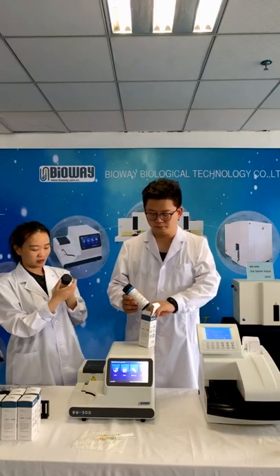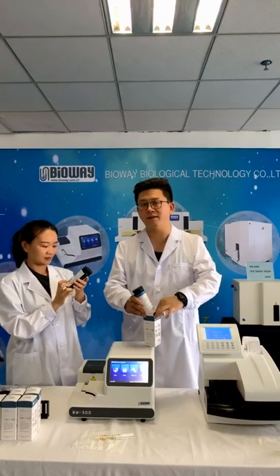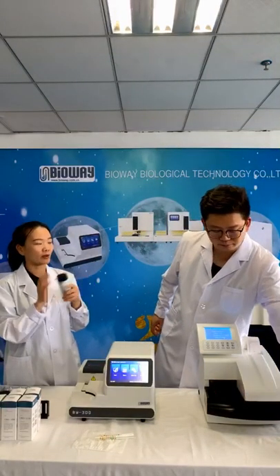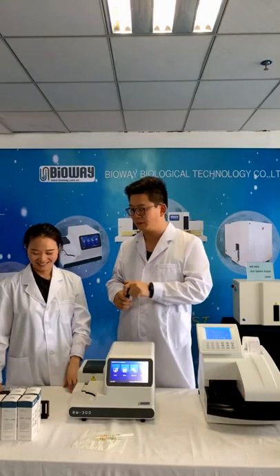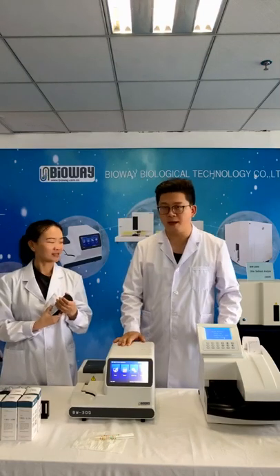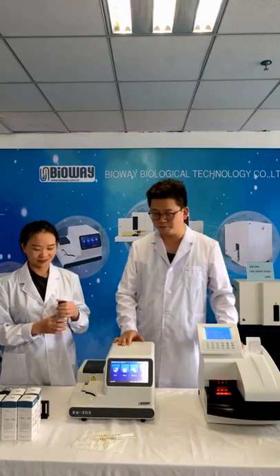So what is the expiry date of one bottle of strips? The warranty term for the urine strips is 2 years, unless you open it. How long can we store it once opened? When you open the bottle of strips, I suggest you use them all within 1 week. And the storage condition? The ambient temperature should be room temperature, and the humidity should be no more than 80%.